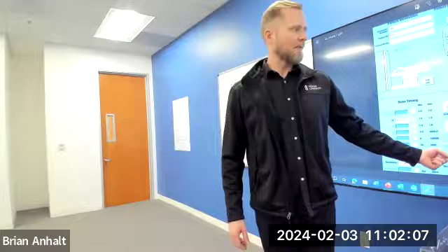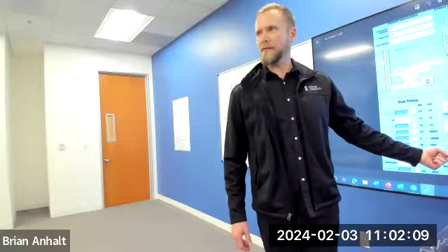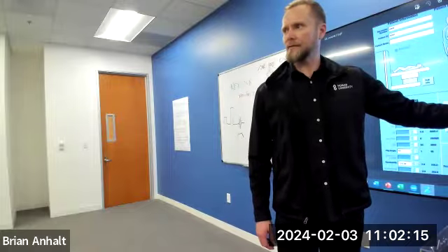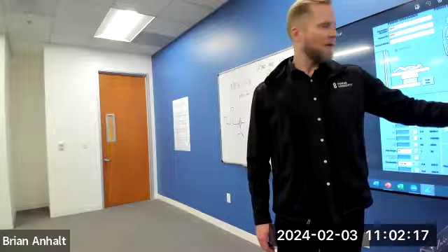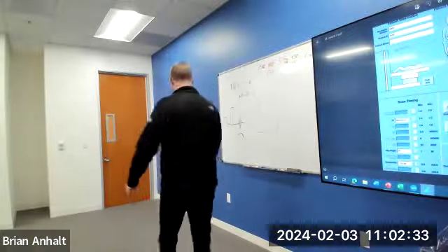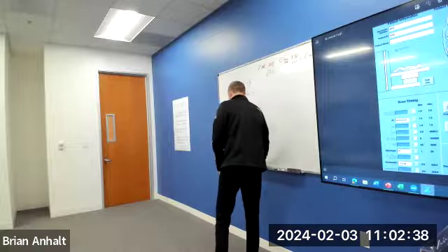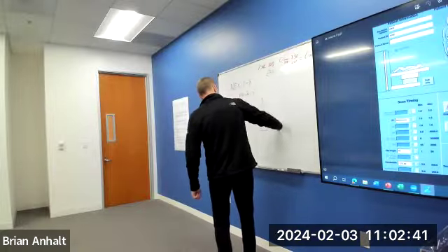The pixel area is our field of view divided by something called our matrix. And we have 2 different matrices. We have a frequency and phase matrix. Think about a pizza as your field of view. Your matrix is how many pieces you cut that field of view into. Let's not think about a round pizza. Let's think about a Sicilian pizza. They're square, right? And rectangular. How do you cut those pizzas? Into squares, right? That is kind of what we are doing in MRI to determine our voxel volume, or our pixel area. So this is my Sicilian style pizza.